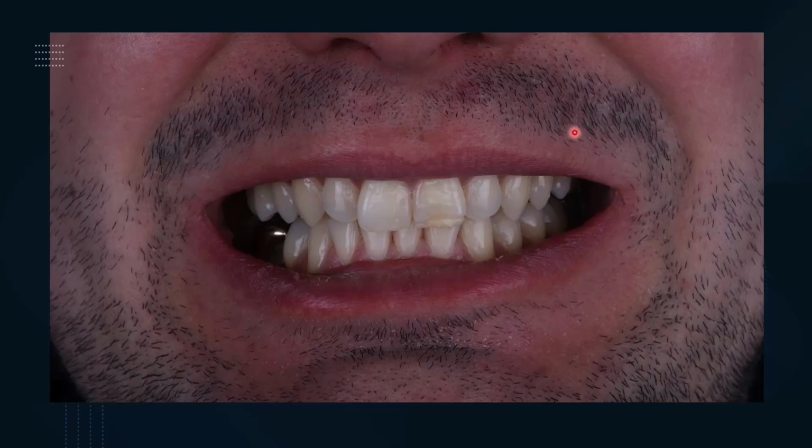Buccal corridors in this case, the simple descriptor on these buccal corridors is that they are quite dark on the right hand side. Otherwise, I would describe them as reasonably well developed.